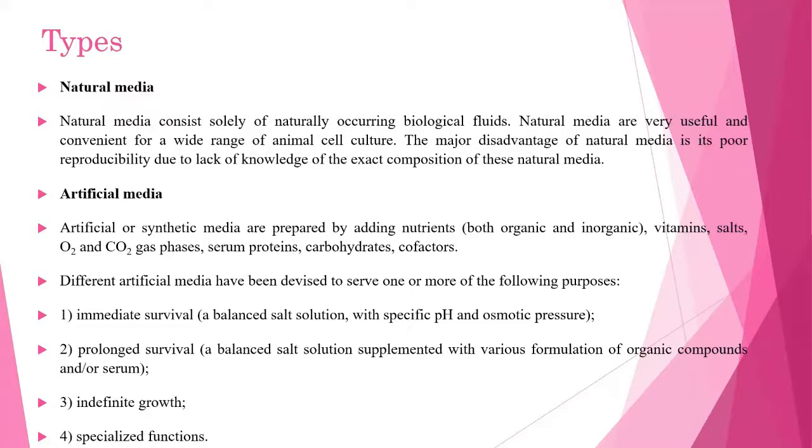the first thing you do is put it in a balanced salt solution, for it to get adapted to the condition and also for it to survive. The cells should not die. If you just remove a small piece of tissue and leave it on a glass plate until you finish your other work, you cannot get a good amount of cells from it. For the cells to survive, we keep it in this balanced salt solution for it to get adapted and to survive till you go and do the culturing process.